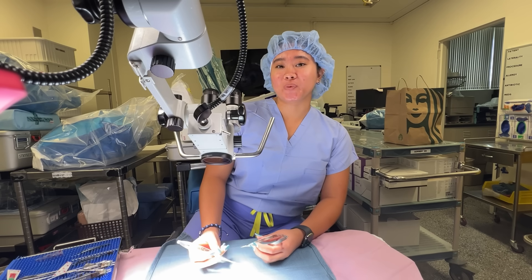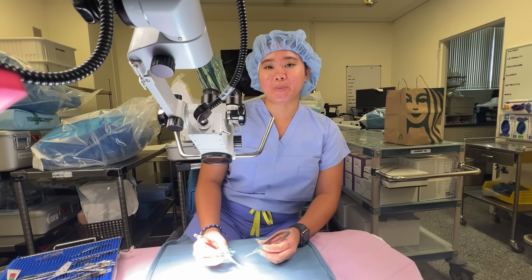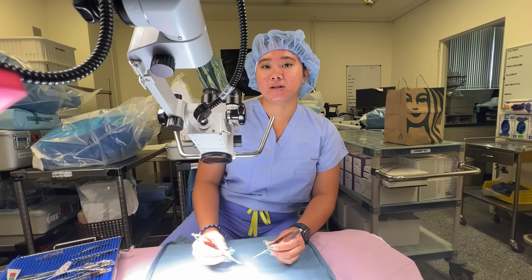Hi, my name is Katherine Morey. Today I'm going to demonstrate how to sew under an operating microscope using an 8-O nylon suture.